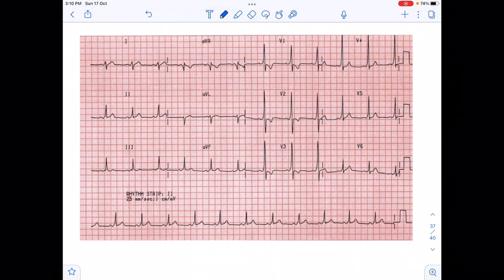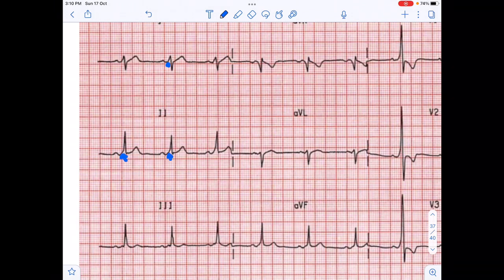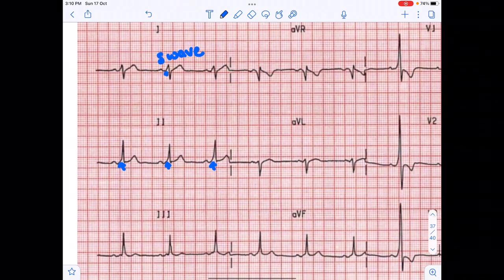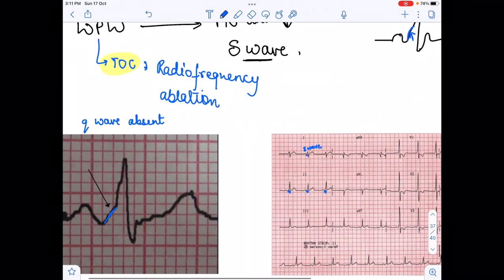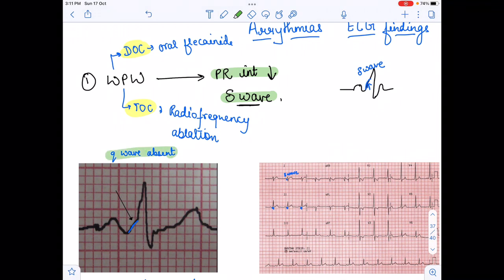On another ECG of WPW syndrome, as we zoom in, we see slanting — this is the delta wave. These are all delta waves. So in WPW we find three findings: PR interval is reduced, delta wave is present, and Q wave is absent. These three are the findings for Wolf-Parkinson-White syndrome.